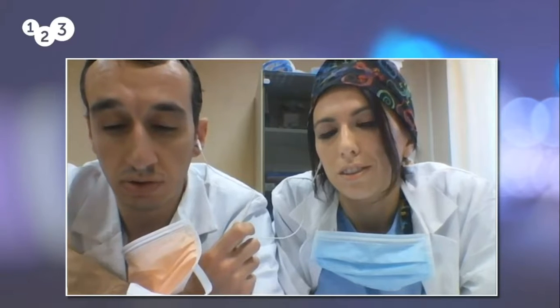There were many CT scans of these patients. Now we prefer to do this type of exam in selected patients and do other types of exams, in particular ultrasound, that can be one of the best tests to understand if there is a suspected pathology from COVID.